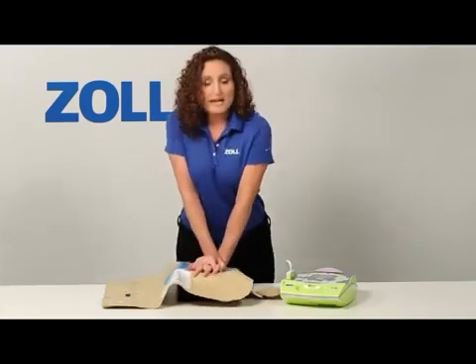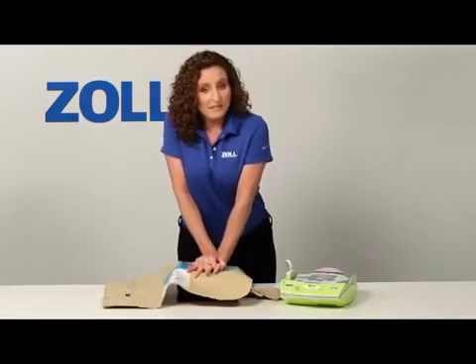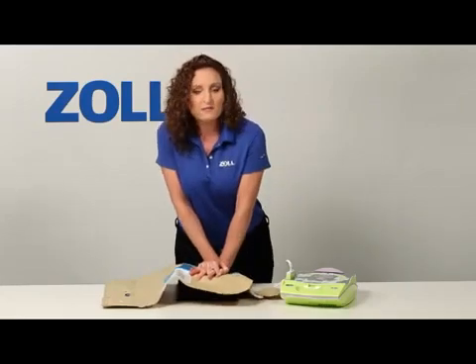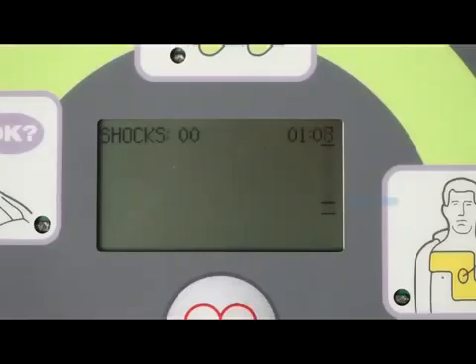When I start back up, the beeps begin again and are synchronized to my compressions, and again speed me up to at least 100 compressions, as recommended by the American Heart Association. The upper line represents 2 inches, while the lower line represents 2.4 inches. When you do good compressions, the bar should at least cross the upper line.